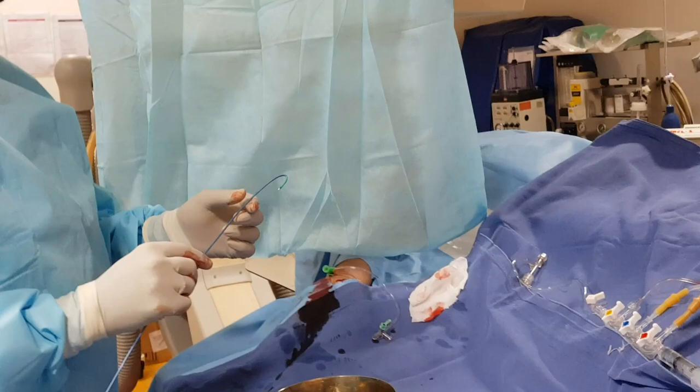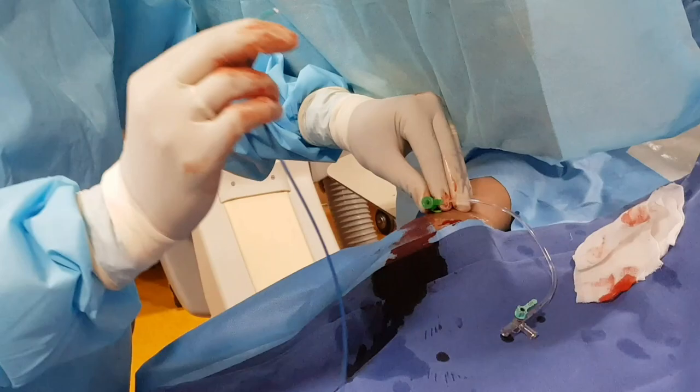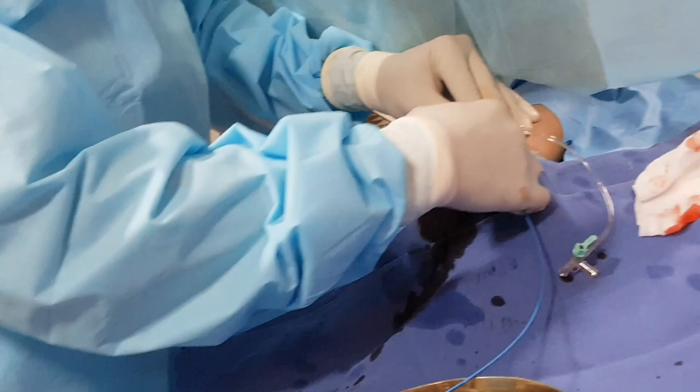This is an extra backup guiding catheter — a six-French guiding catheter. It is through this guiding catheter that we pass the wires, balloons, stents, etc. Now I am advancing it over a wire; I am inserting it into the sheath. And then under X-ray guidance we will be passing everything into the hardware.